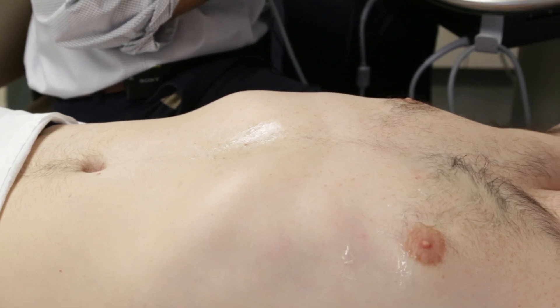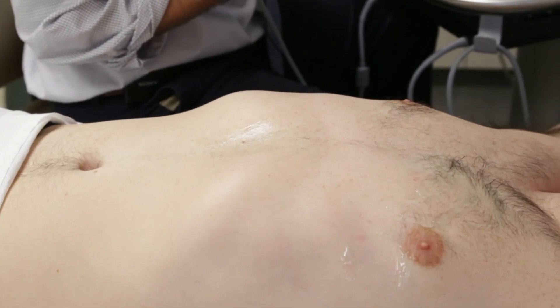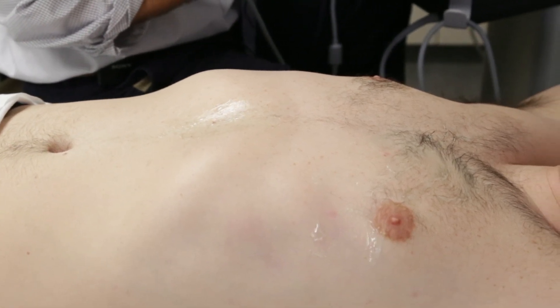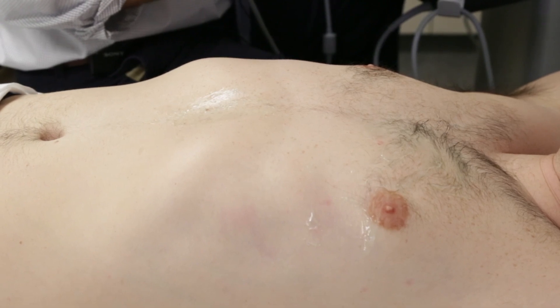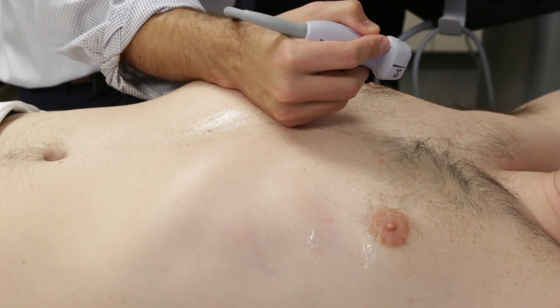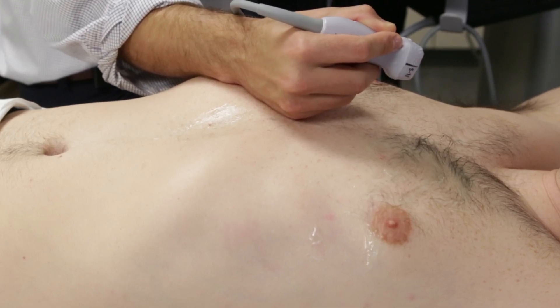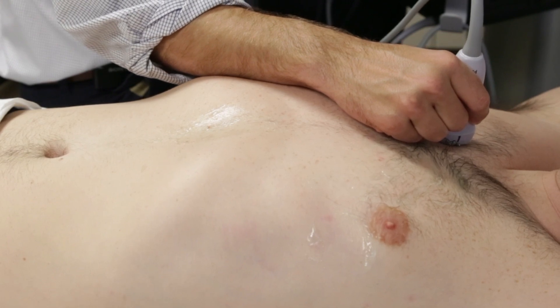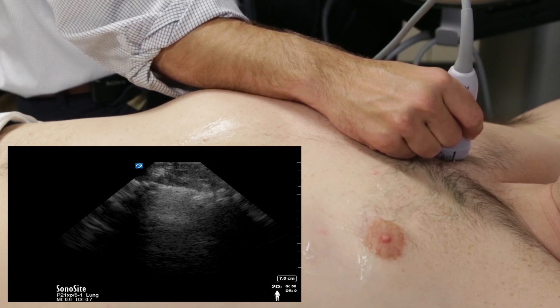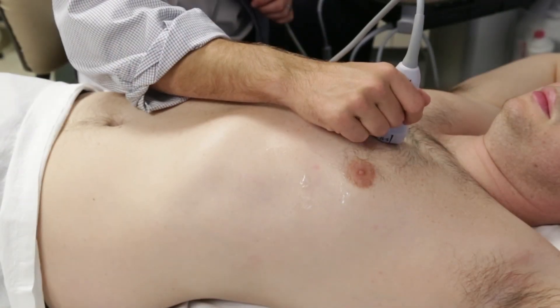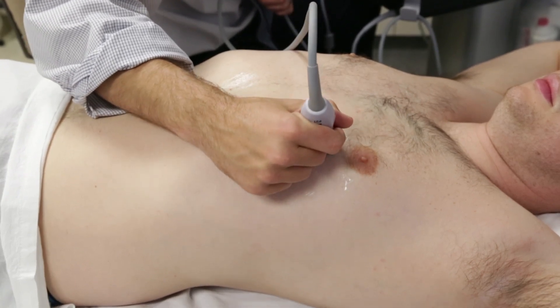We now move to the lung ultrasound portion of the thoracic exam, where we will briefly demonstrate the use of ultrasound as a diagnostic tool for lung and pleural pathology. Generally speaking, ultrasound waves scatter when confronted with air, so lung ultrasound is more about interpreting reverberation artifacts in aerated and partially aerated lungs. The exam starts with the patient in a semi-upright position. The phased array probe is held with a pencil grip, the probe marker directed cephalad, and the screen marker located on the upper left-hand portion of the screen. Lung ultrasound is conducted by examining one hemithorax at a time and checking three lung zones per side: the upper anterior, the lower anterior, and the posterior lateral.